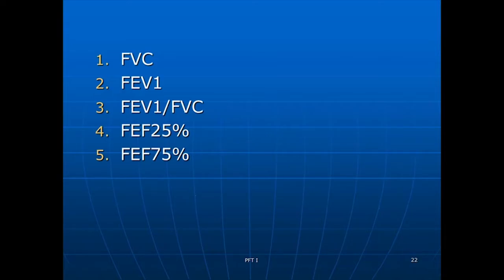We're assessing volumes in the first three. These depend on effort: how quickly the patient can exhale that in 6 seconds, and how forcefully they can exhale that in 6 seconds. So these depend on effort, and they all look at volumes.